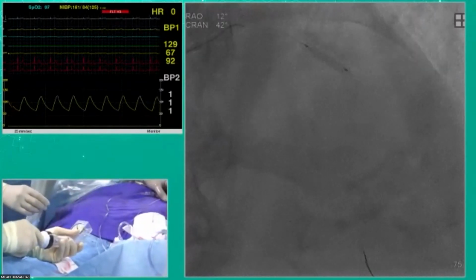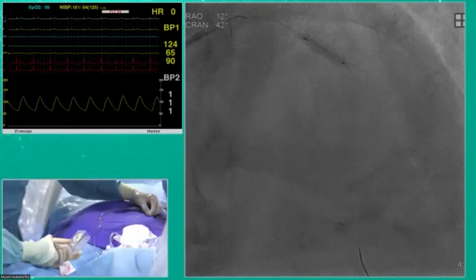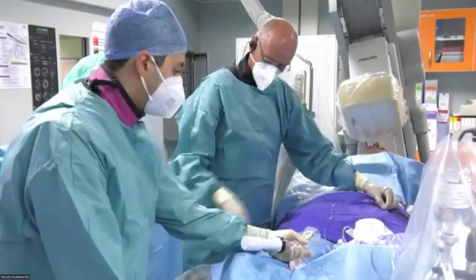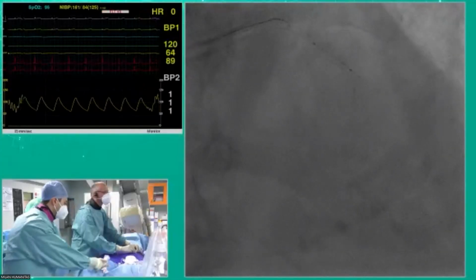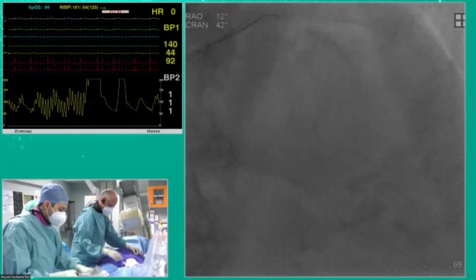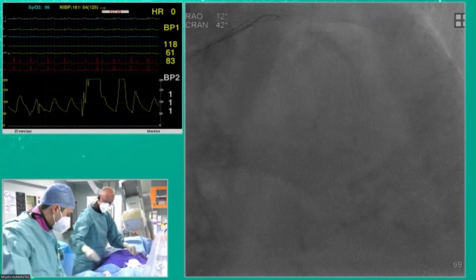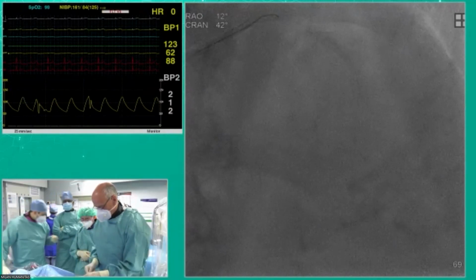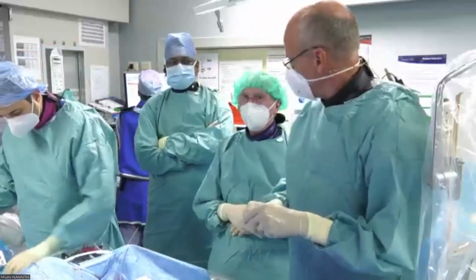And to your point, this is all cutting-edge stuff, and there are studies going on right now comparing this strategy to more conventional strategies. We assume that they're going to be positive, but we don't know that. There is a small chance of leaving behind a dissection that you have to come back for, and people on the panel were talking about that being a problem. So we'll have to see. But in most of the studies, the reported chance of abrupt closure with this type of strategy is very, very low. Antonio is also one who, if he had a flow-limiting dissection, would put a stent in. It's happening about 30% of the time or so. It's still useful to have stents in the cath lab.